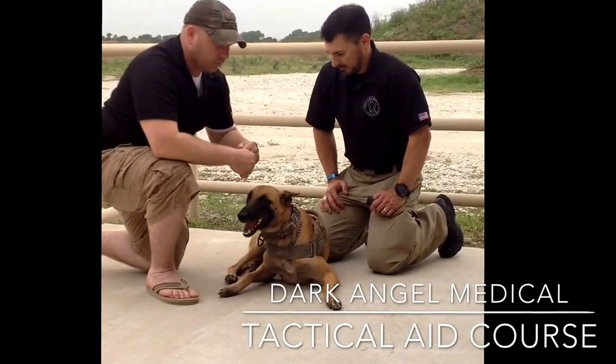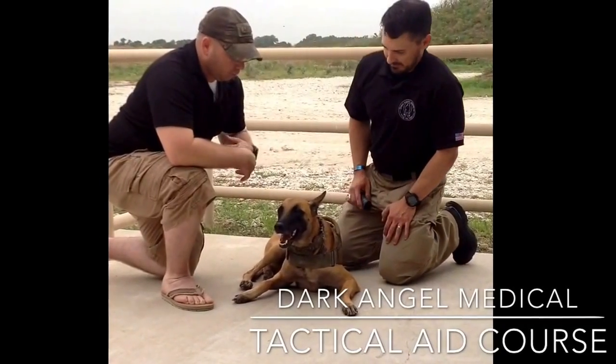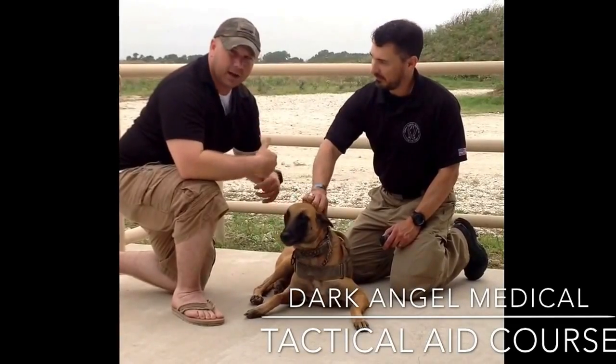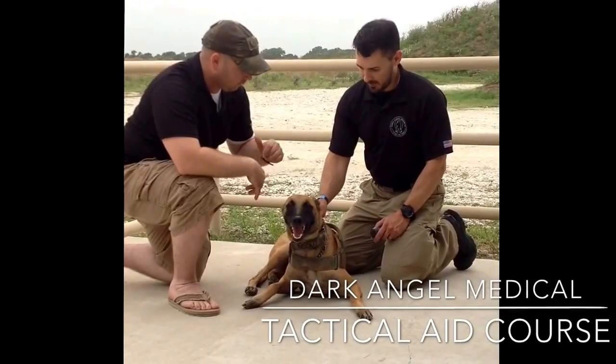We go through a lot of work on applying tourniquets for humans and how to put it on ourselves, but you're seeing more and more guys who have working dogs or support dogs, and sometimes you need to be prepared on how to treat your partner or your battle buddy. Doc, if you could walk us through a tourniquet for a canine.